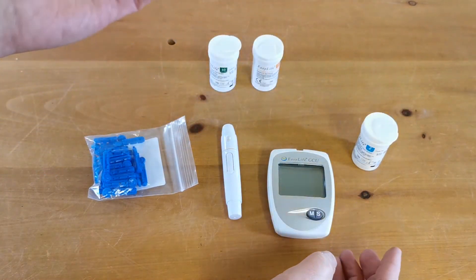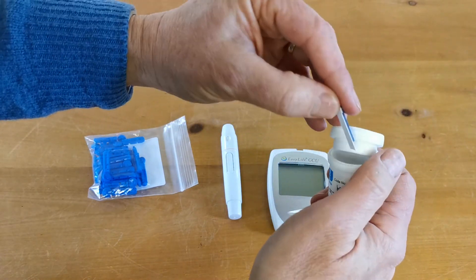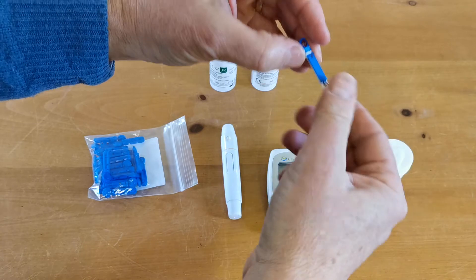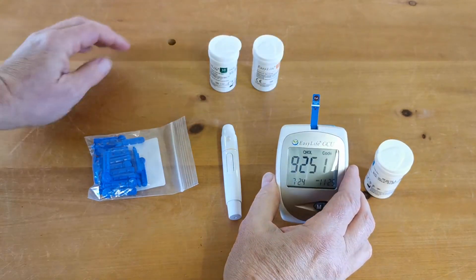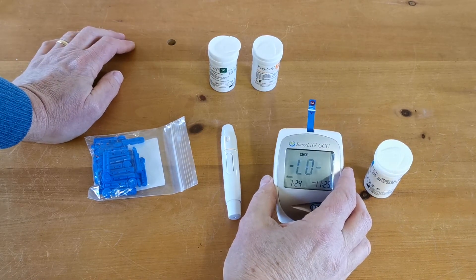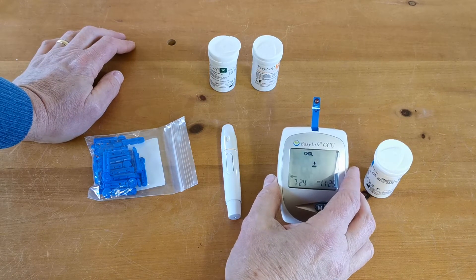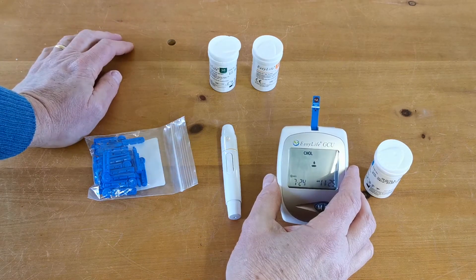Nothing happens when you first put that code chip in, so if we then take one of our test strips and insert it into the top of the meter you'll see the code reference displayed, and then in a couple of seconds the calibration is taken and you'll get that flashing display.